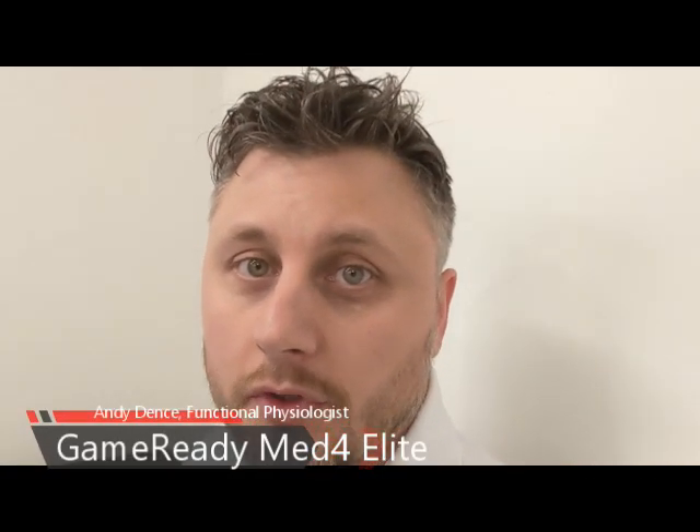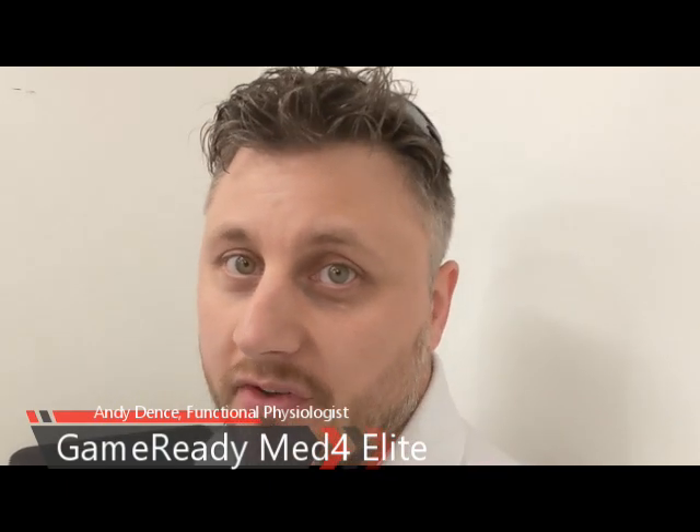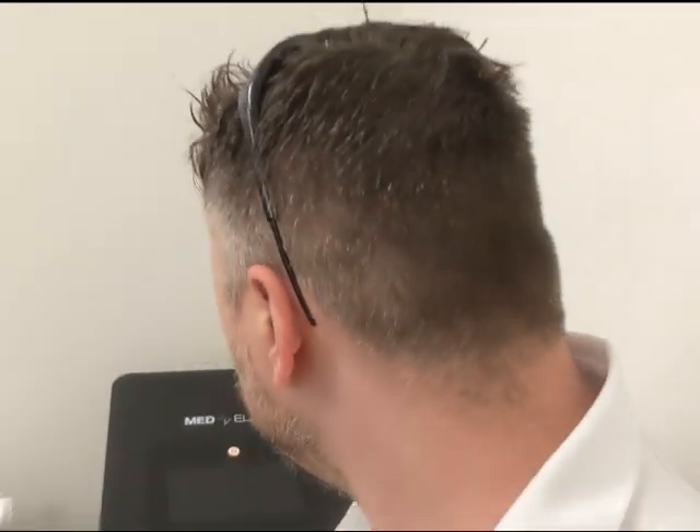What's going on everybody, Andy here. I'm going to show you how to turn on and set up the Med4 ice compression system that we use here at the Swamp Fox Performance Lab. As I walk up to the device, you'll notice it's got a blank screen and the light is amber — that means the power supply is turned on from the back to the wall. I press the amber button — it's a touchscreen — notice how it just turned green.